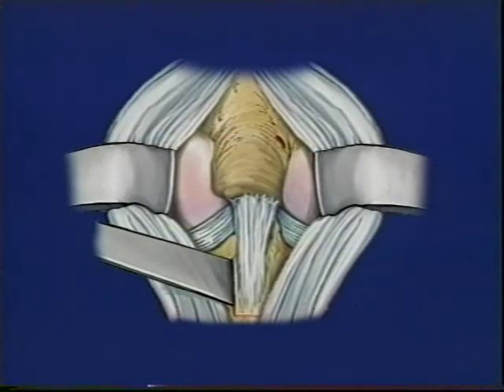This diagram shows the area where the new posterior cruciate ligament will be placed and the bone that will be removed.